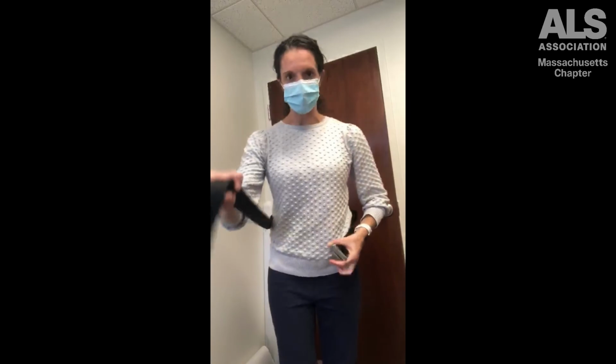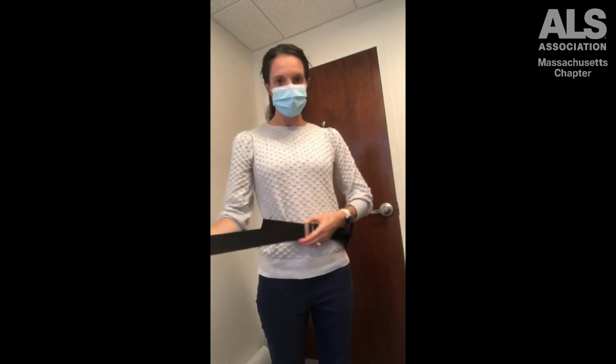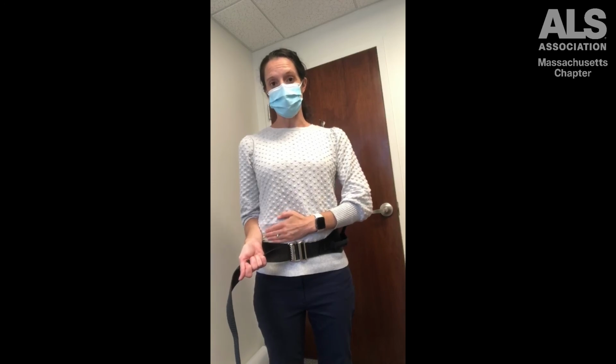The key to using a gait belt is to have it very, very tight, really as tight as you can get it without causing any pain. And if you're working with a feeding tube, you may have to put some padding there so that you're not pressing right into it. I've seen people put a towel there to go over it. I would definitely talk with a nurse or have a PT help you figure out how to navigate a feeding tube if you have it.